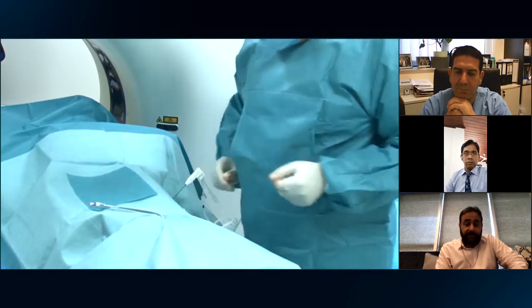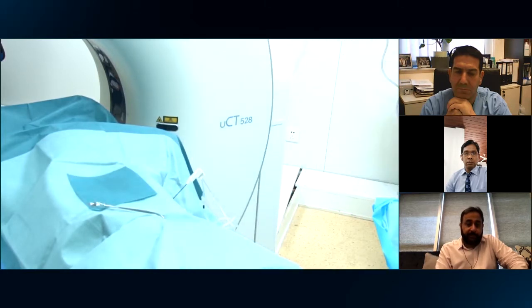So he just inserts an extra 2 centimeters and makes a scan to see whether the antenna is in the right position.